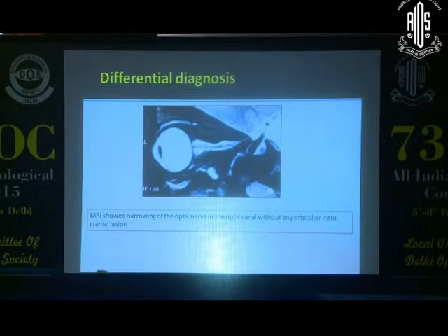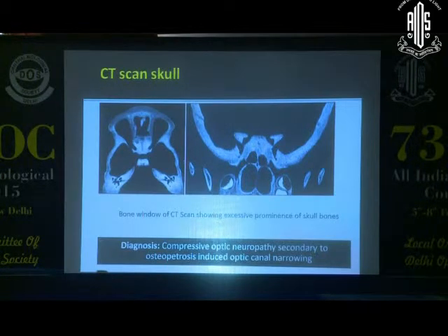Okay, I can recall this is one of the patients in which when we reviewed the MR in the regular rounds, we found that this optic nerve appears a little too pinched to be normal. And more importantly, what we noticed was that there is marked thickening of the superior wall of the optic nerve. We didn't know what's happening. We wanted to go back to the CT because CT is where the bony details are unrivaled. You get excellent osseous details in the CT. So which is what we did. So we went ahead with CT.